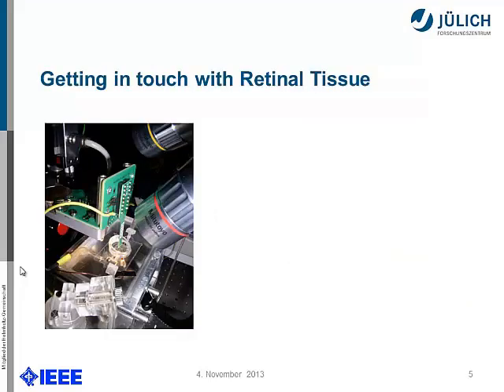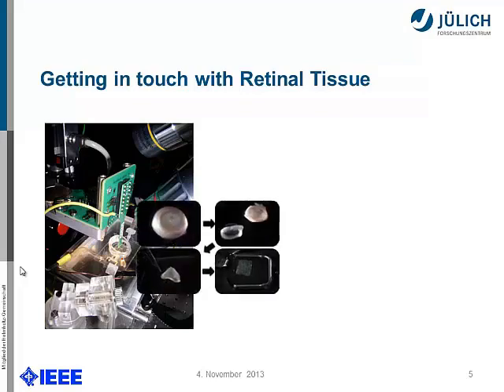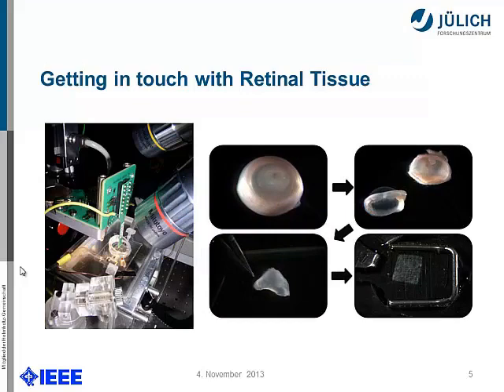This is what the biologist would start with: looking at the retina in a petri dish, with an electrode shown in real size. When we have a closer look, we see the rat's eye being prepared. The lens is removed, the biologist takes out a small piece of the rat's retina, cuts a very thin slice, and places it underneath — I think it's dental floss — just to keep it flat on a special surface.